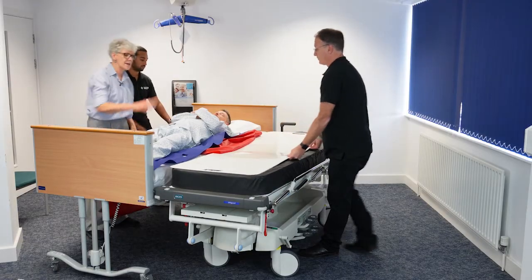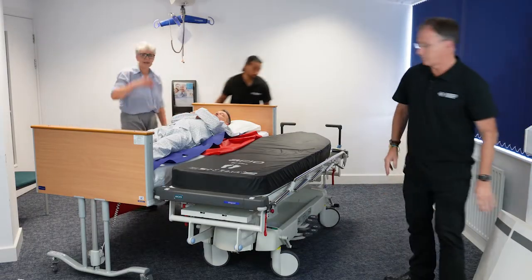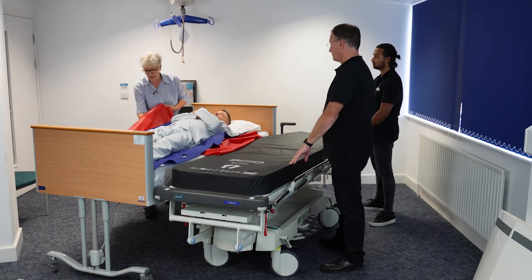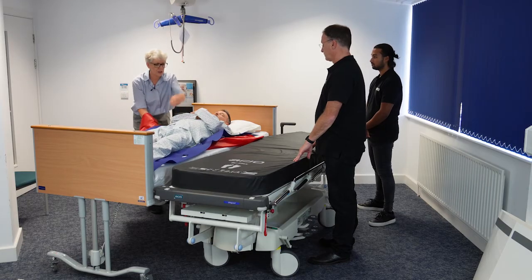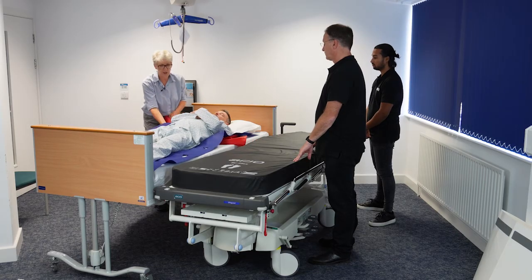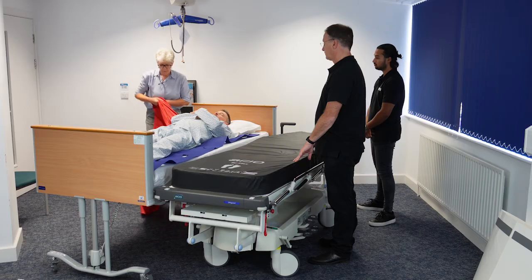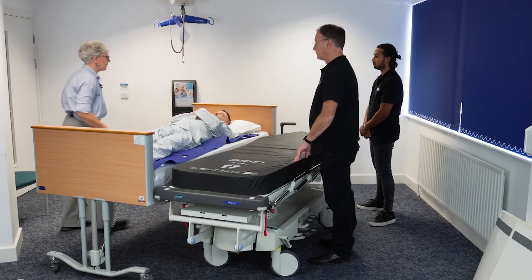Once we're happy that he's in the bed, we can remove the transfer board. At this stage I need to take the slide sheet out. I've got much more slide sheet on this side so it makes sense to do it from here — bringing my hand through the middle, grabbing the bottom half and pulling. You can see it pulling out underneath him. I'm using my step stance, soft knees, transferring my weight and gently pulling it out. I'll keep that slide sheet for a little bit later when I'm sure we'll need it again.